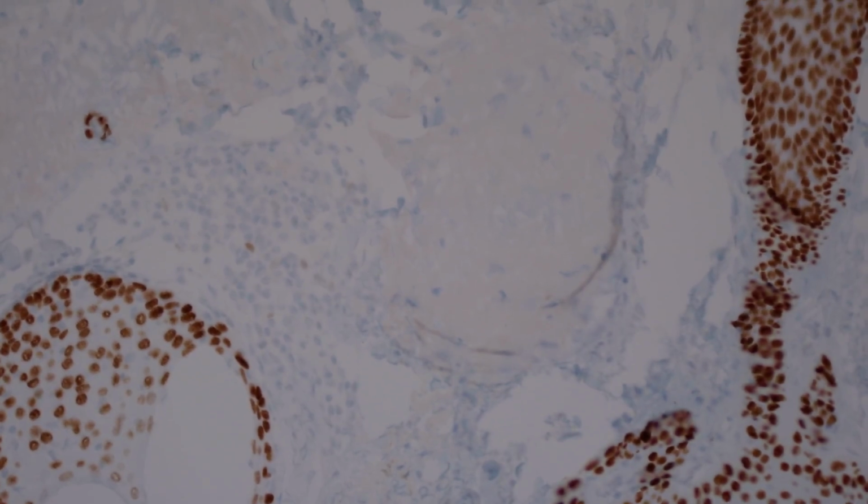And so here you can see it's a little bit weak. It's hard to get the light quite right on these immunostain videos. So these little structures here are the glandular portion of the eccrine coil. And you can see that most of the cells in there are actually negative, but these cells on the outside, the basal layer of cells, or the myoepithelial layer of cells, are nicely picking up the p63. And then as that moves up into the duct, you can see that those p63 positive cells become more concentrated, and there are a lot more of them as the duct moves up towards the surface.